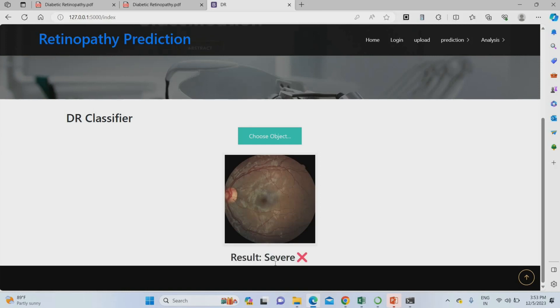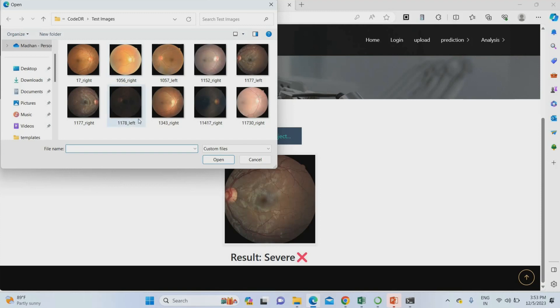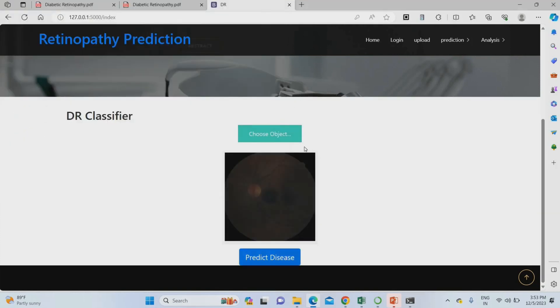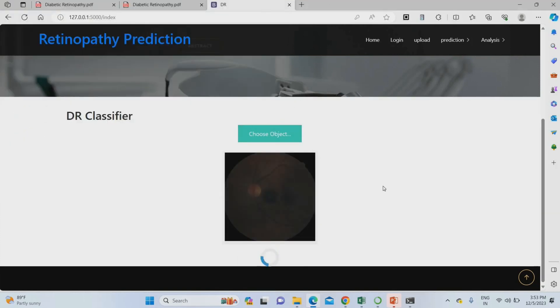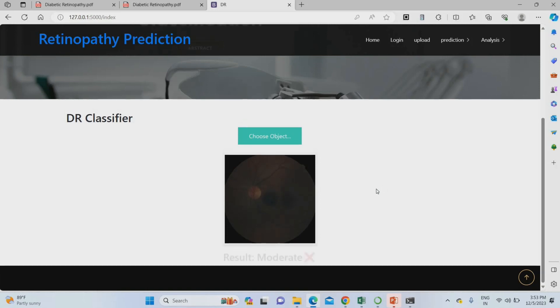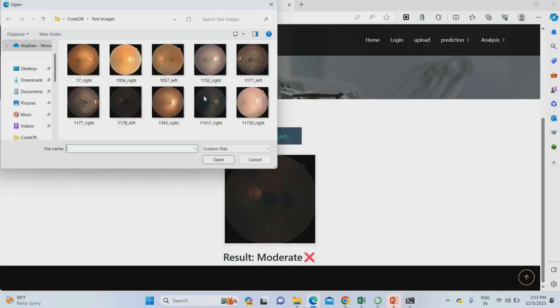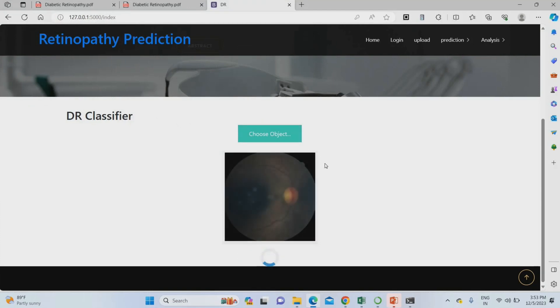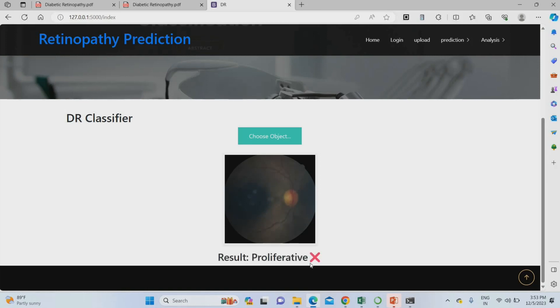The image uploaded belongs to normal diabetic retinopathy. Uploading another image — this one comes under the severe diabetic retinopathy category. Uploading one more image — this is the moderate disease. Uploading another — this is proliferative. This is how the project works. You can upload any images from the internet or doctor-collected images and it will work perfectly.